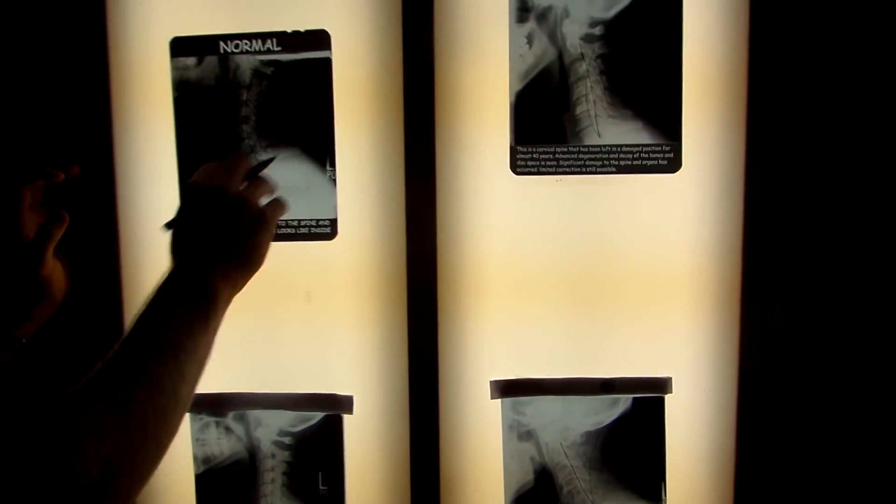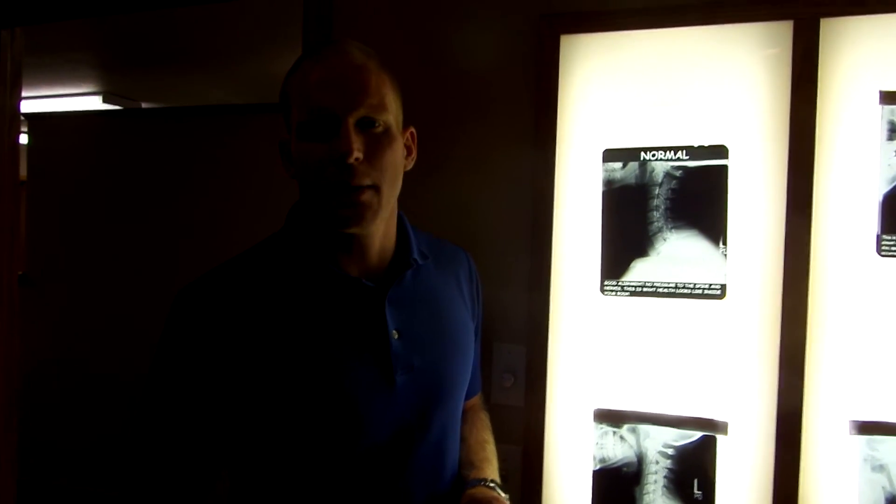So these are what x-rays look like when we take them. That's how we evaluate them and see what phase you are. We can identify where you are in that process and try to stop or slow it from occurring. Just because you may not be having symptoms doesn't mean you don't have any degeneration starting in your neck. Remember, it happens over a long period of time — 5, 10, 20, 30 years — so it can be there for 5 to 10 years before you notice any symptoms.